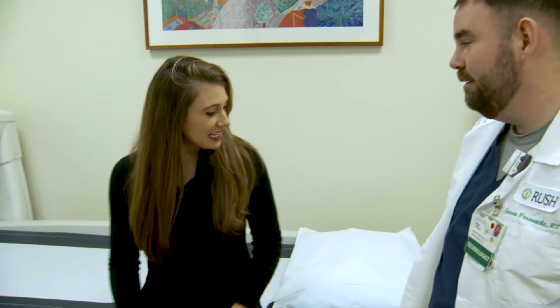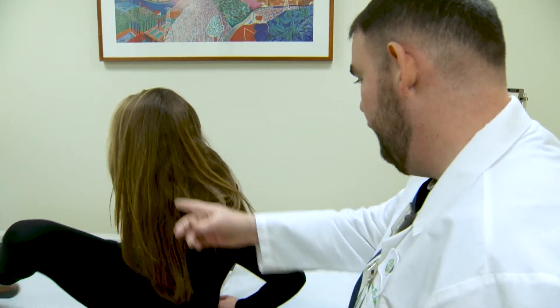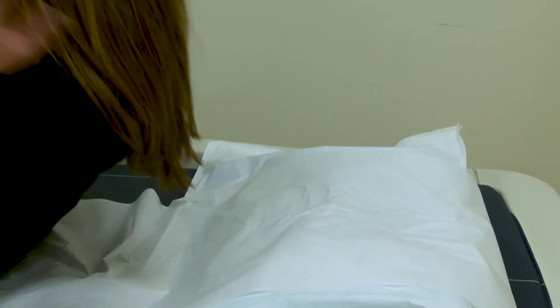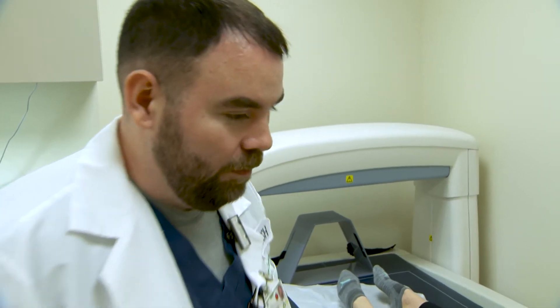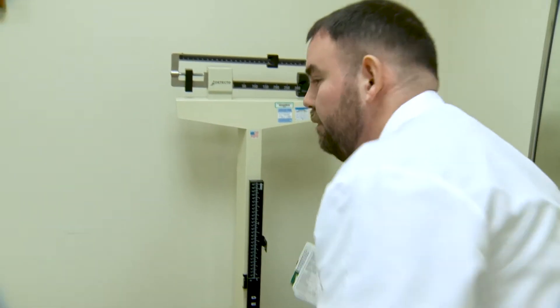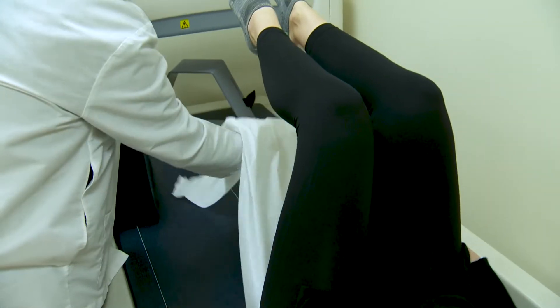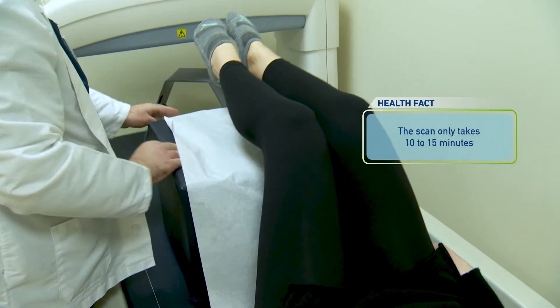Hello Jason. So how do I lay down on this? Head's going to be on the pillow, feet at the opposite end. We'll be putting a leg block under the legs for the spine scan. I'll have you lift up both legs and rest them down.